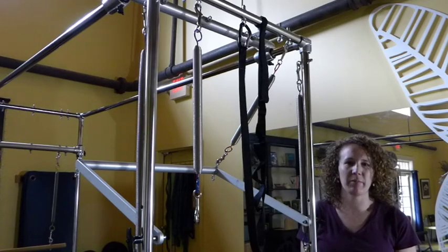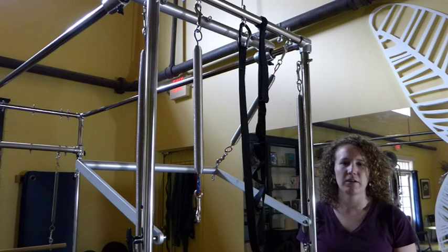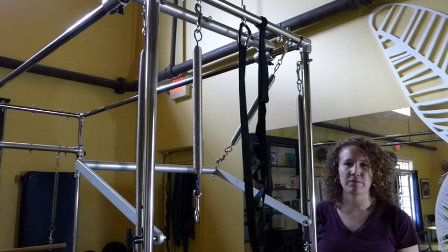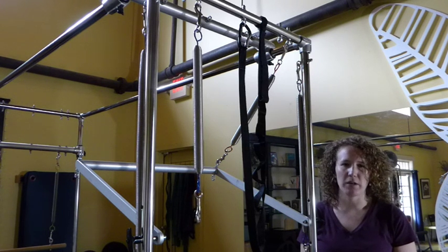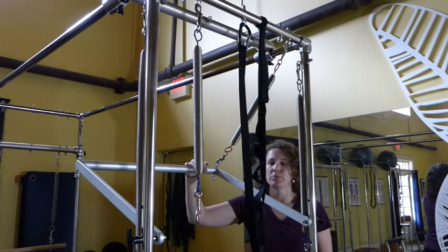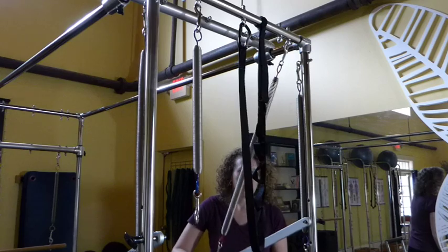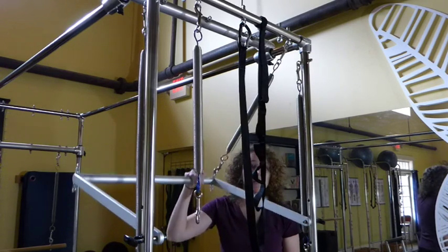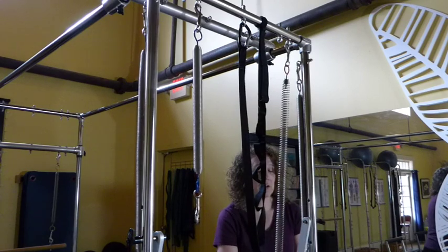The next thing we're going to talk about is everything that affects the function of your machine. There are lots and lots of noises that develop and are really annoying. One of them can be from your eye bolts. As you're using your push-through bar, over time, the eye bolt might get worn down. Can you hear that creaking noise?